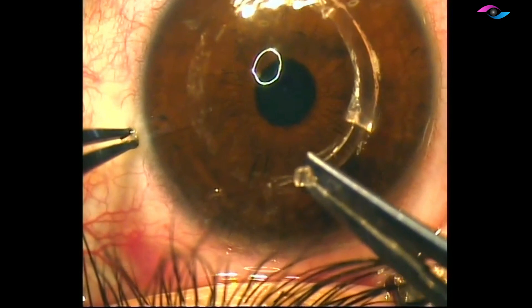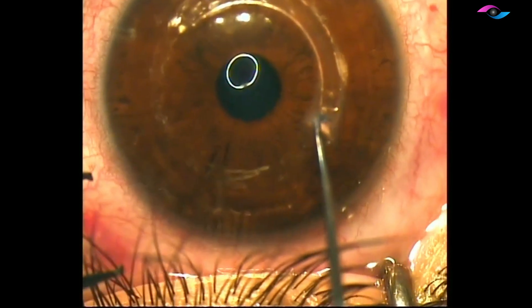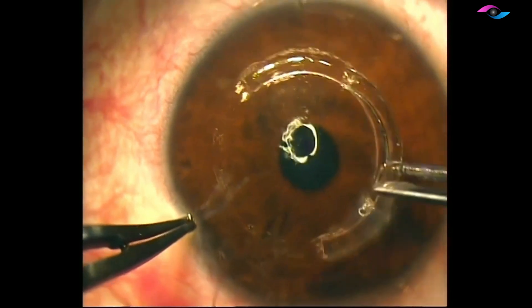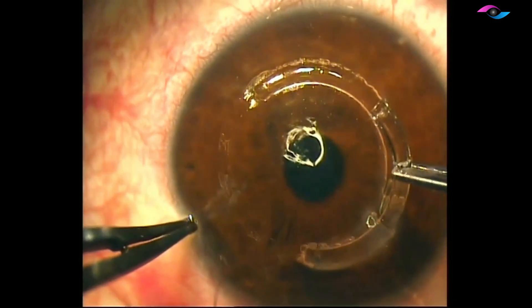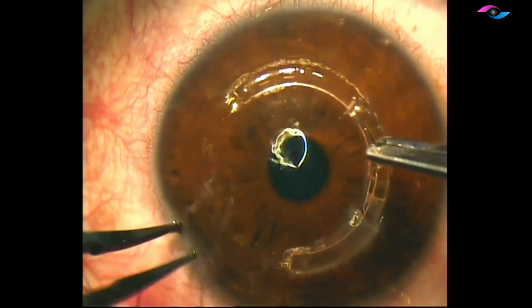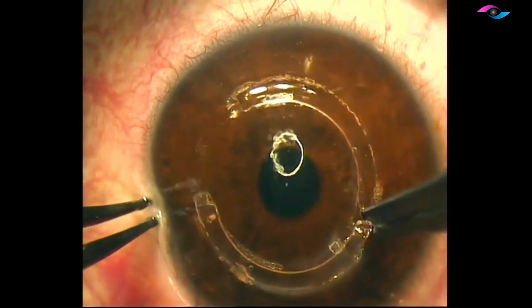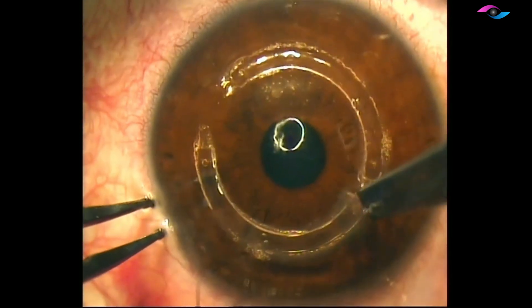It is important to wash and irrigate the channels with antibiotics before placing the segments inside, making sure that no epithelial cells track into the channels. We are now placing the other segment, and we need to push them a little inside so that they are away from the main incision — this avoids extrusion of these segments.